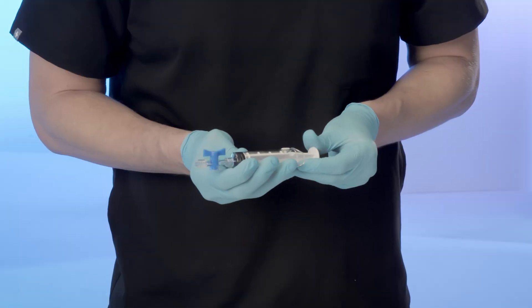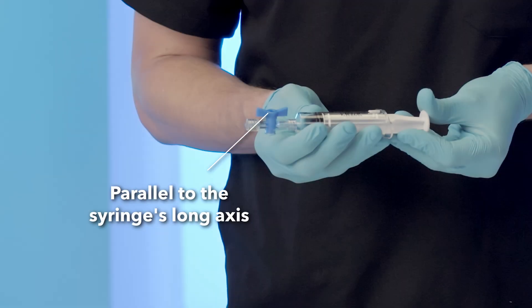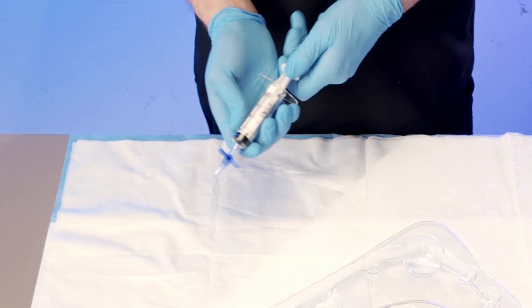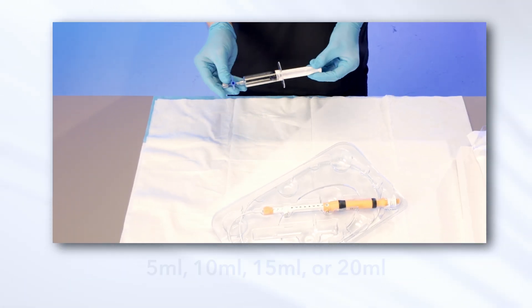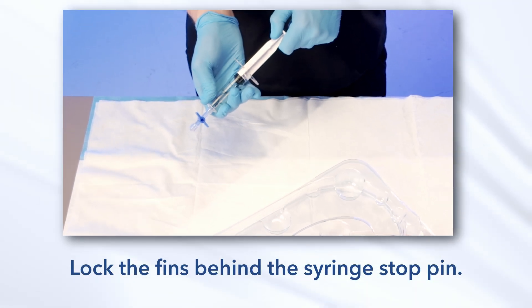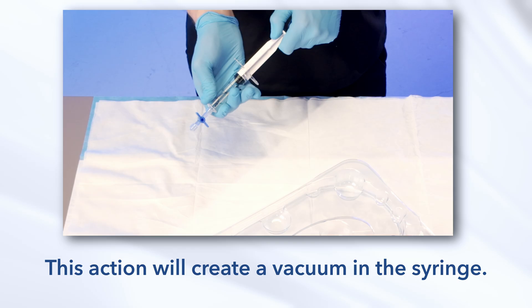Examine the syringe and stopcock. Open the stopcock by turning the lever arm until it is parallel to the syringe's long axis. Fully advance the plunger and rotate it counterclockwise until it stops. Turn the stopcock 90 degrees to the closed position. Retract the plunger to the desired position — 5 milliliters, 10 milliliters, 15 milliliters, or 20 milliliters. Lock the plunger in place by rotating it clockwise to lock the fins behind the syringe stopper. This action will create a vacuum in the syringe.